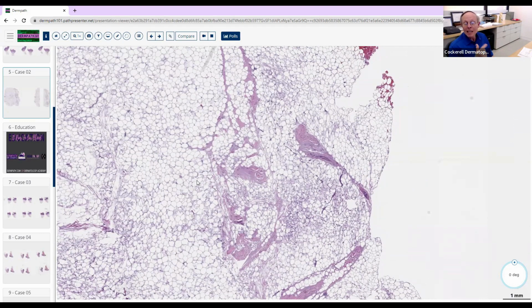And sometimes that vascular component can be the majority of the lipoma. You can have 80% of it be vascular, and just a little bit of it be the residual lipoma. So that's obviously an angiolipoma. You mentioned pleomorphic lipoma.